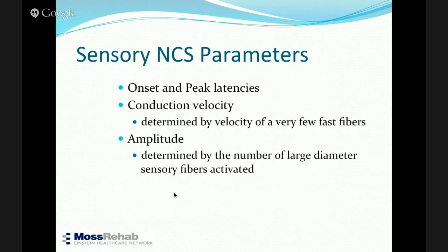So when you're looking at sensory conduction, you're looking at, again, onset latency and peak latency. The reason why I mentioned both of them is this. A lot of people, by convention, started looking at peak latencies because the initial machines, 30, 40, 50 years ago, had very poor resolution. So they could not really see a good onset point. So they could see a bump. So they said, well, the peak is the best thing to look at because these are very small responses.